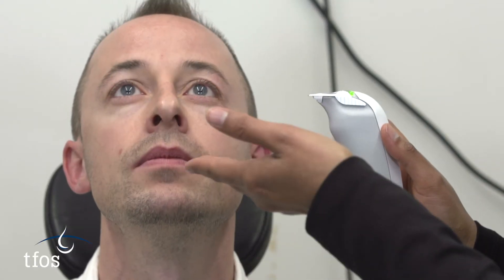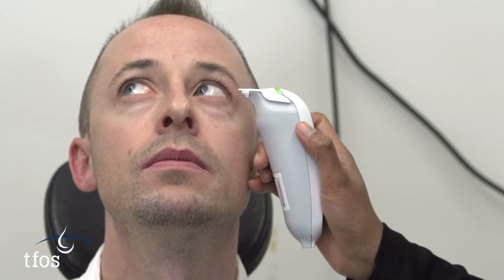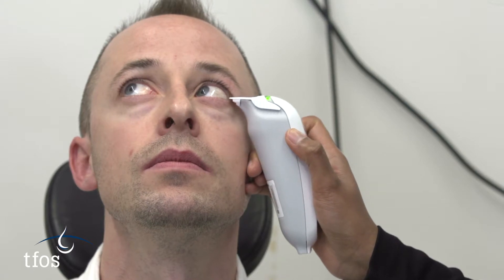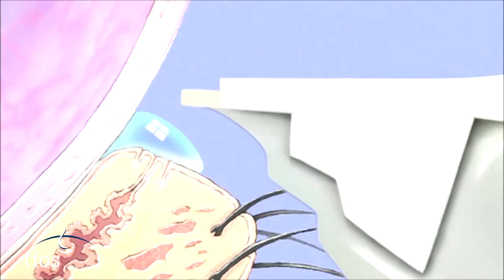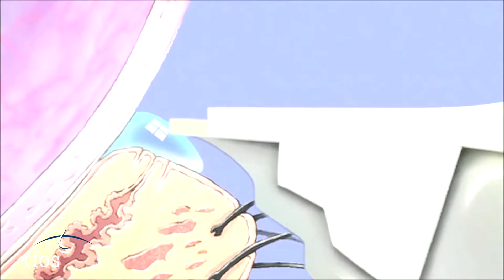Without delay, the patient is requested to look upwards and nasally to expose the lower temporal meniscus to the clinician. The nib of the pen is then lowered into the meniscus, taking care not to contact either bulbar conjunctiva or the inferior lid margin. The sample of tears will be drawn automatically by capillary action into the test card.